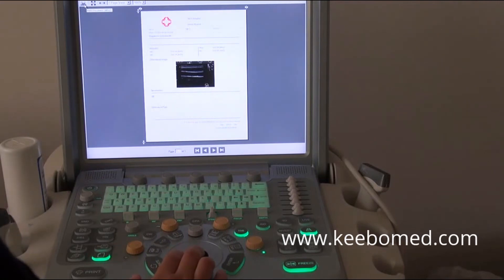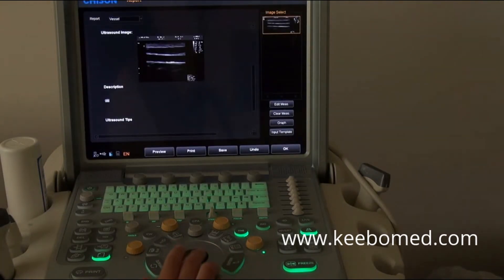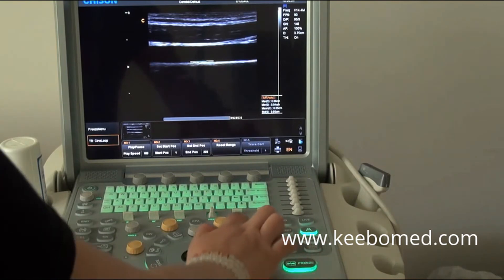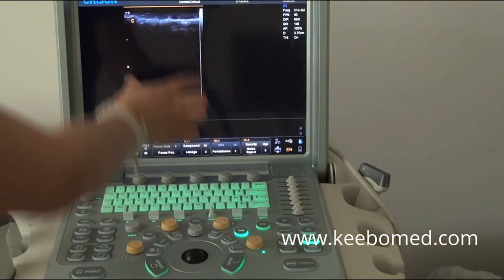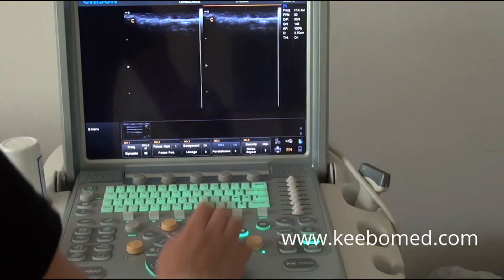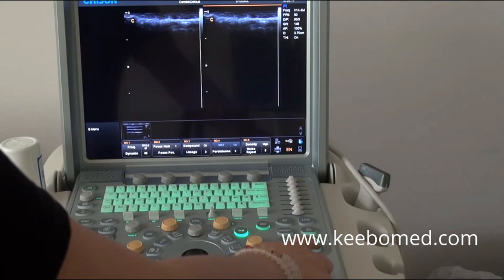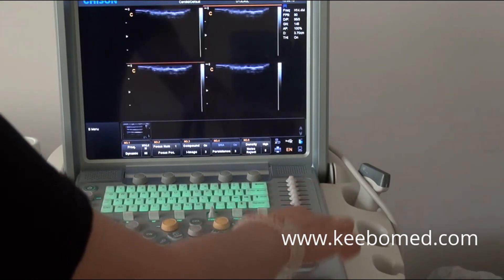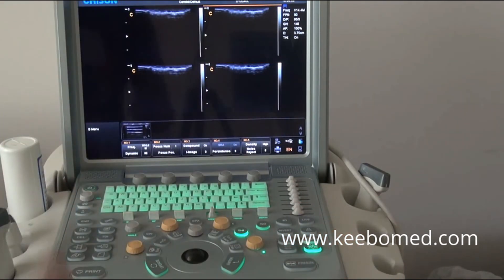This button is one-key print. Also, if you want to go into 2B mode, press the 2B key. Press it again and it will switch to another 2B image. For 4B image it's the same — press it four times and it will go into 4B mode.